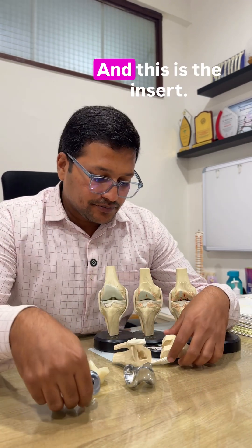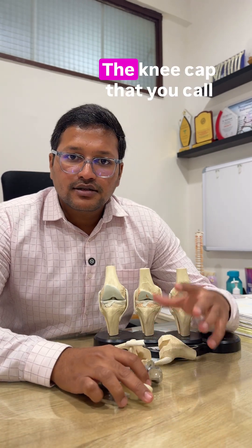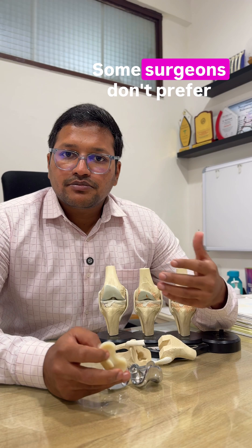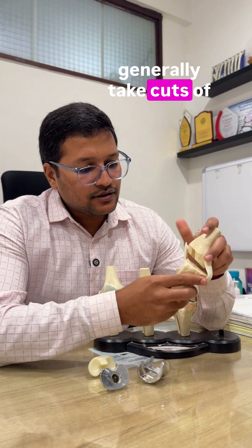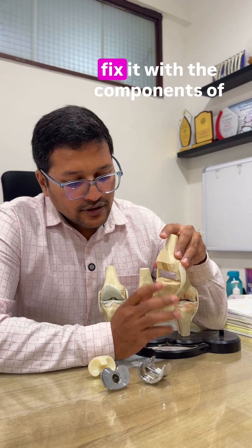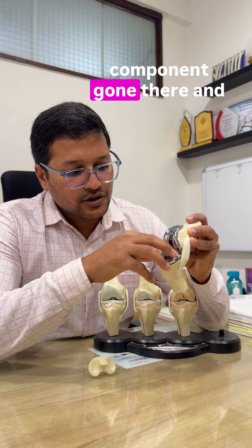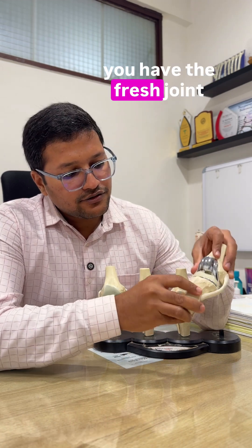This is the tibial component and this is the insert — these are the three components. There is one more component for the patella, the kneecap. Some surgeons prefer to use it, some don't. This is how we generally take cuts of the bone, mechanically align the joint, and then fix it with the implants by cementing. That's the tibial component in place, and now you have the fresh joint.